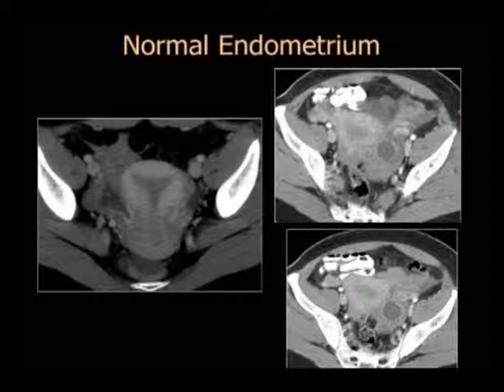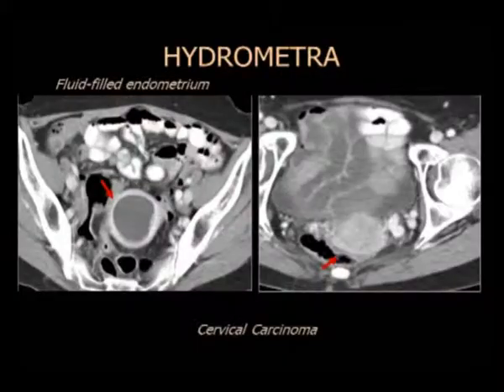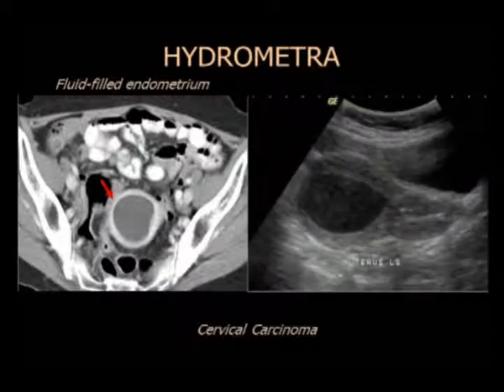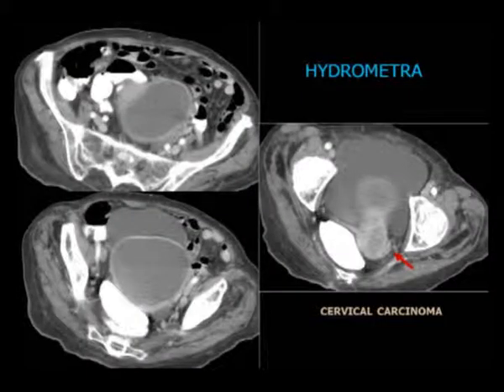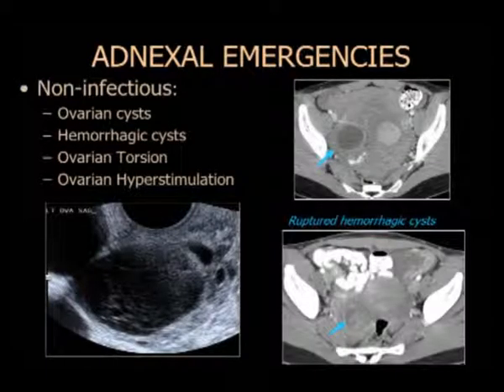No es fluido endometrial, es simplemente la fase del ciclo que cambia su forma. Cuando empezamos a ver una imagen redondeada, cuando ya no hay triángulo, hay que pensar en fluido endometrial. Esta paciente tiene un pequeño carcinoma cervical con fluido en la cavidad. Otra paciente: gran distensión con el útero lleno de fluido, y hay un pequeño carcinoma cervical.